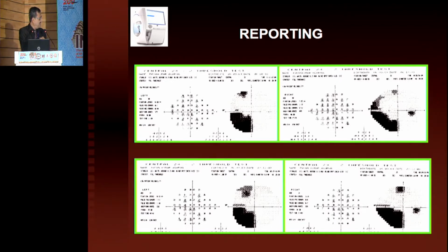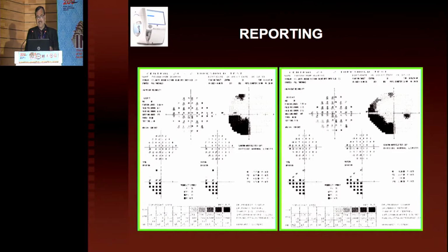So what does it mean? Now I realize that this patient is having an inferior quadrantanopia. Had I known the lesson that I learned the first time, when I diagnosed this only on the Greytone chart in my learning days as an inferior arcuate defect, had I not seen the Greytone chart, what I said, the heart of the printout is here, not here. Had I looked at this 6 months back, it was a classical quadrantanopia, which I missed. So the lesson that we learn from this is any vertical separation is neurological, any horizontal separation is probably glaucomatous.